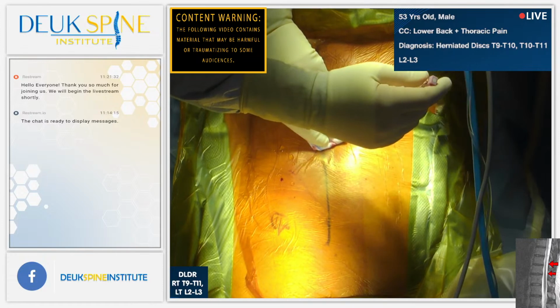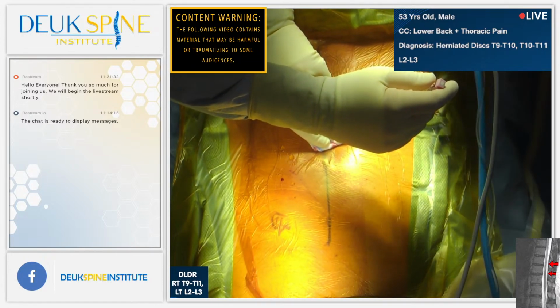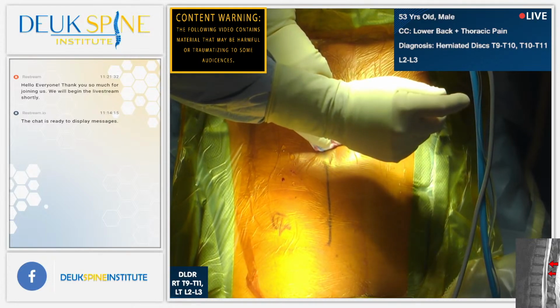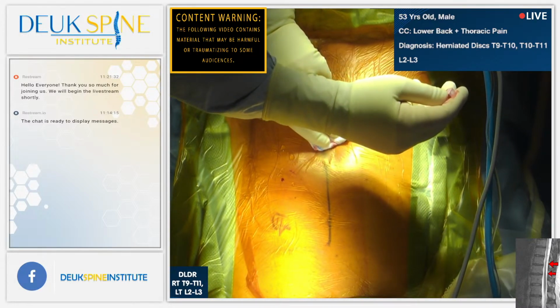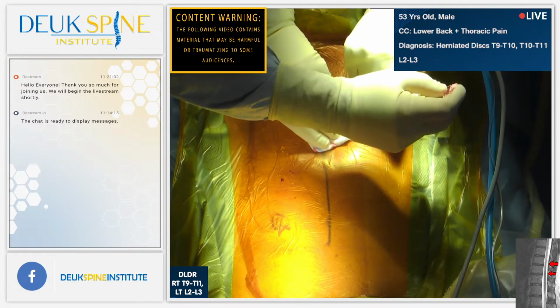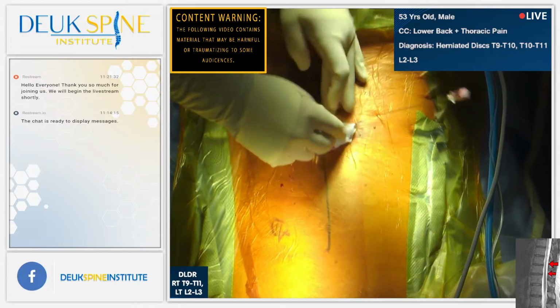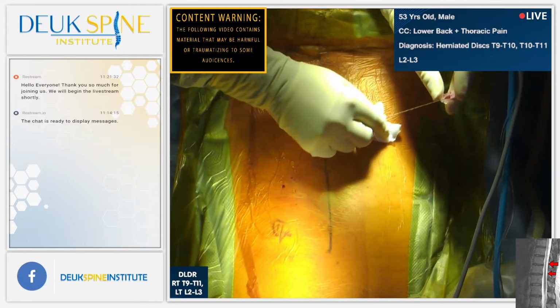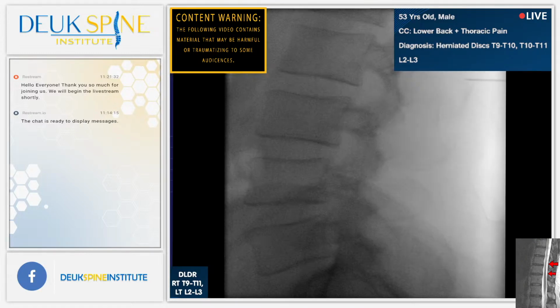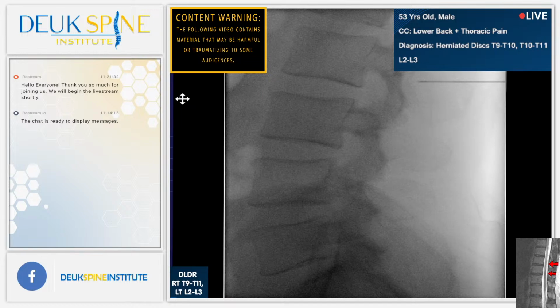We are going to be fixing a few discs in this patient. He presents to us with pain coming from what we believe is the L2-3 and the thoracic T9-T10, 10-11, correct? Yes, sir. All right, just stay where you are. We're first going to access these discs using an X-ray and a needle.